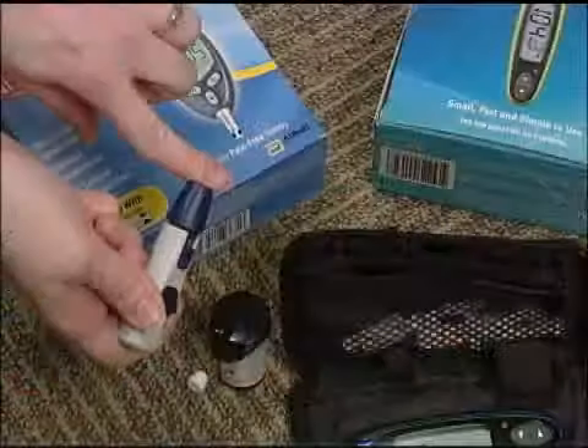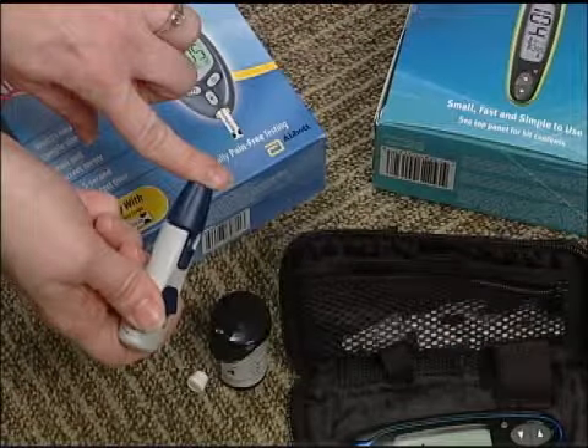Once you've inserted the strip, go ahead and get a droplet of blood from your finger. When you're testing, you want to test on the side of your finger, not in the fleshy middle part. It will be less uncomfortable to test on the side, and you can get just as much blood from there.